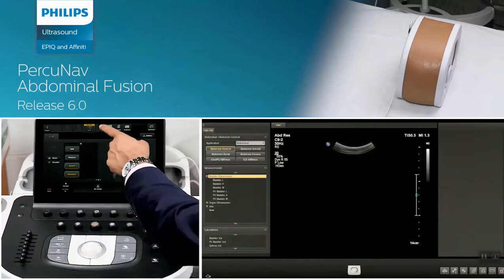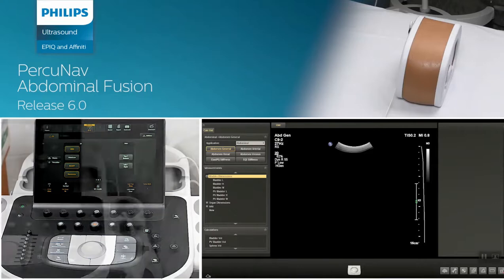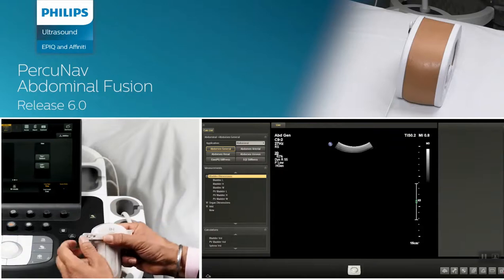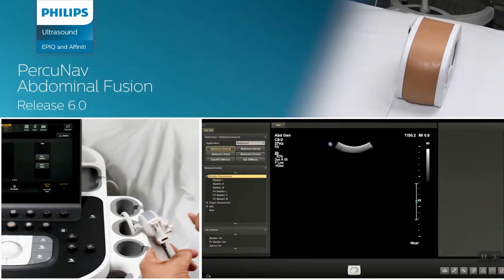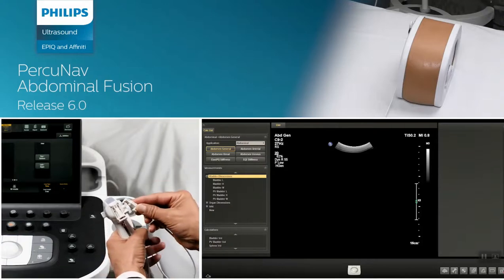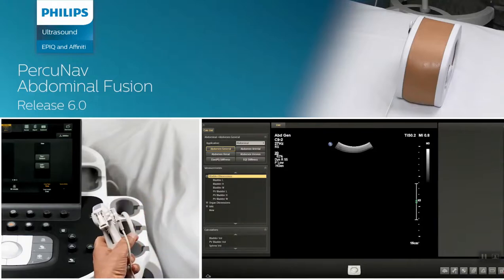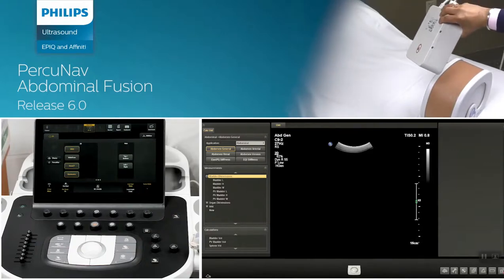Select the C92 transducer and abdomen general preset. Place the transducer bracket on the C92 and mount the transducer tracker. This tracker that I am using is universal and is also compatible with C51, X61, S51 and L12-5 transducers. Position the field generator to the appropriate position for the procedure.